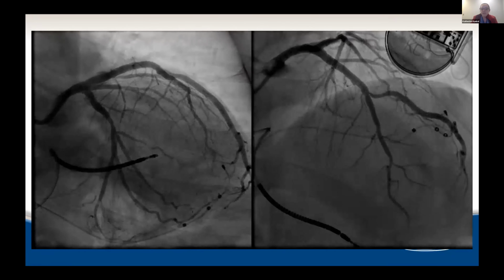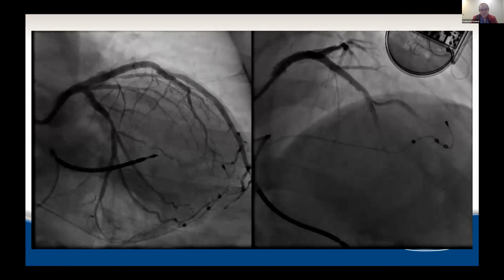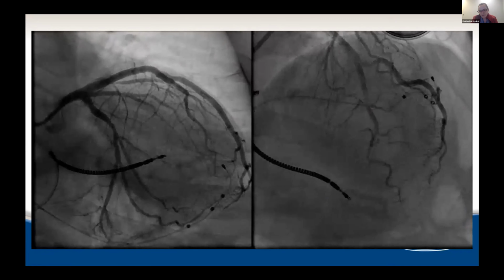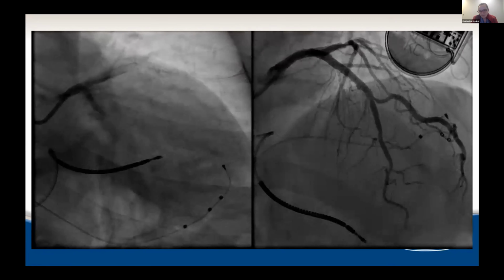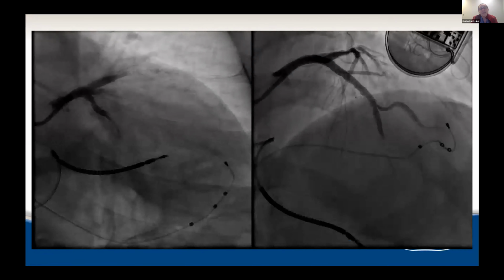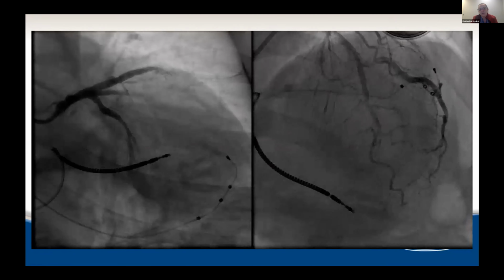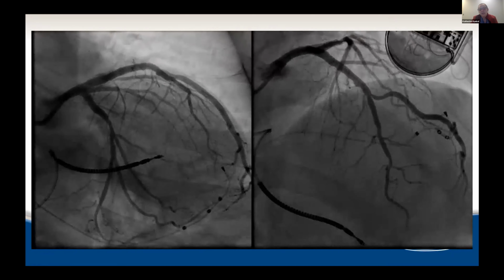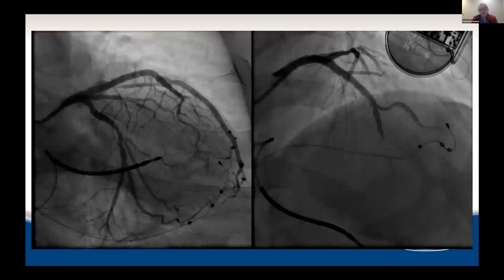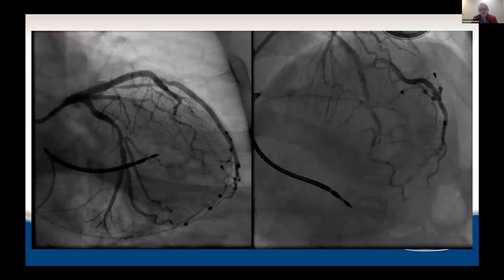Yeah, I think one of the most important things we're looking for, especially in calcified disease, is stent expansion. Ideally we're hitting 90% of our reference stent size based on our proximal and distal reference vessel, but at least 80% stent expansion. That's the threshold to go back and hit a little harder, making sure we're adequately expanded. And of course, really checking those distal edges, because in big vessels like this with big stents, that's important.